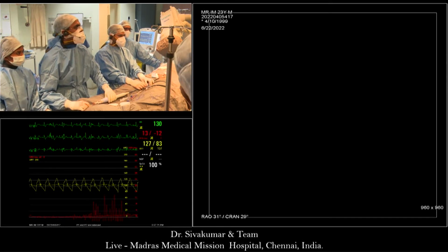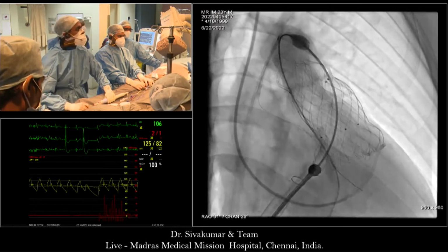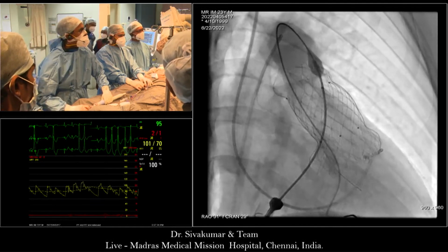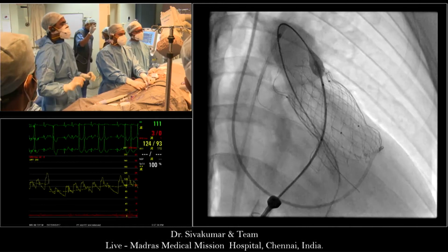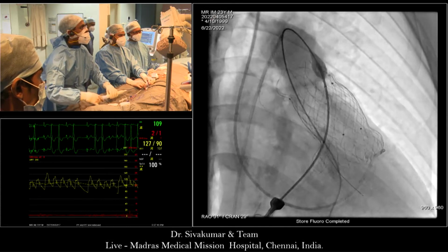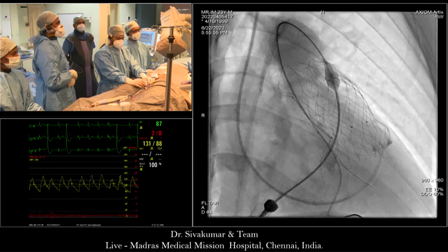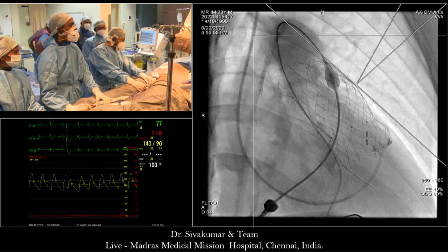Can everybody see them? Yes, they say yes. I am trying to. Careful now, you see the folding. Yeah, I saw that, but how can I help it, Shaq? So on the lateral or LAO, I'm rotating, Shaq. Go lateral or LAO. Lateral. Steady. Lateral, full lateral.